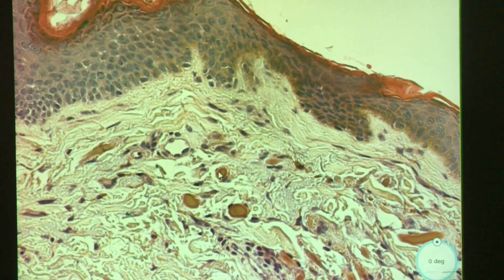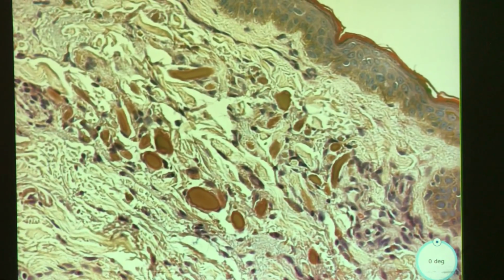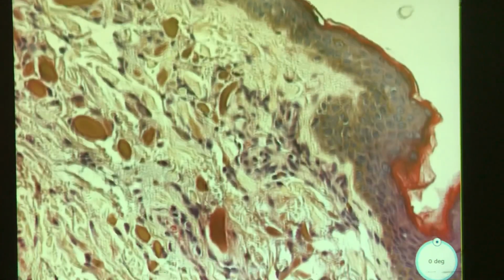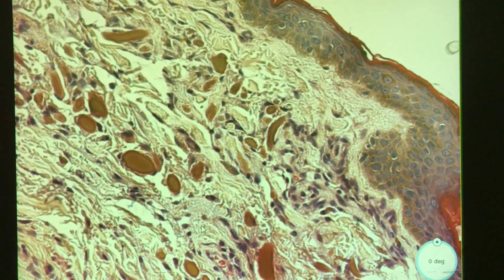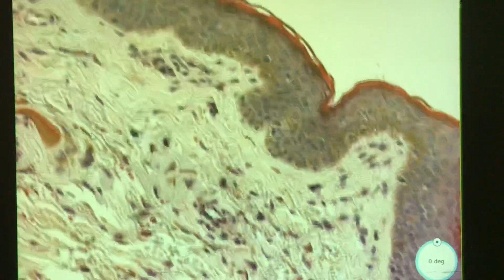Ooh, what are these things? Yeah. There's these pools of very yellowish, sort of amorphous brown ochre color. This is ochre color, yes. There's that buzzword. Okay.